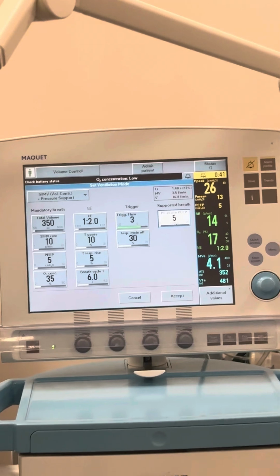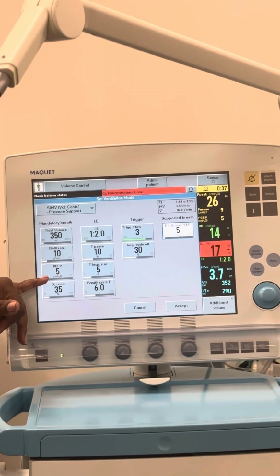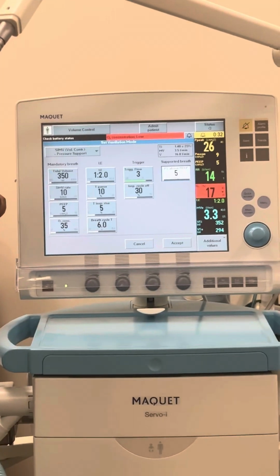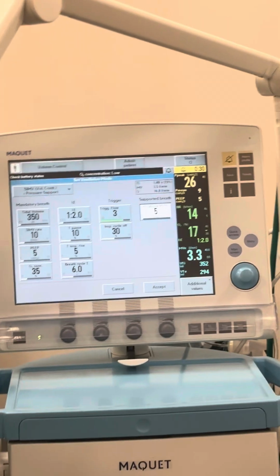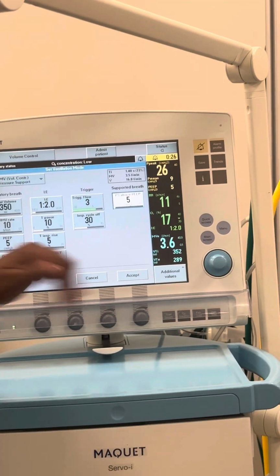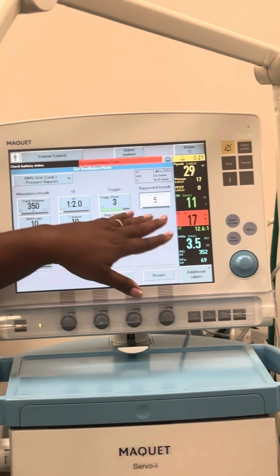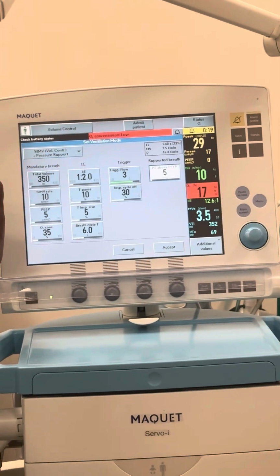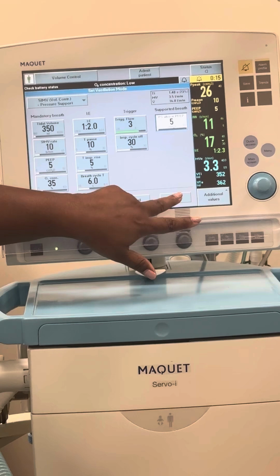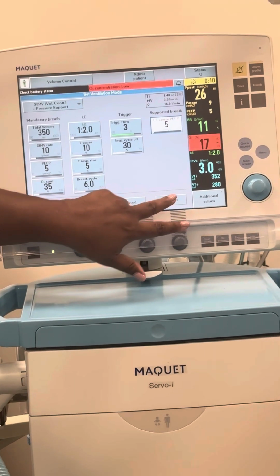You have your baseline 0, and when you add PEEP of 5, you go up to a baseline of 5. So this one is saying pressure support is going to be 5 on top of that. So 5 of PEEP plus 5 of pressure support, so you're actually getting a total of 10. We're going to wean it from here or add more. You're still going to set it at 5, but just know that you're truly getting 10 on this one. That is true. Everybody's good with that? Everybody understands the pressure support above PEEP? Okay.